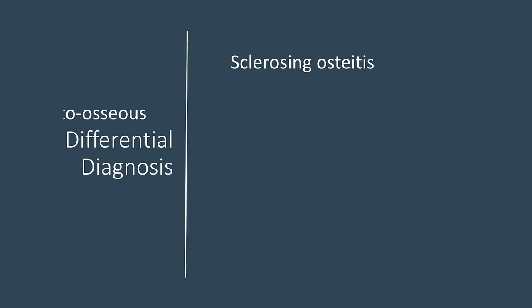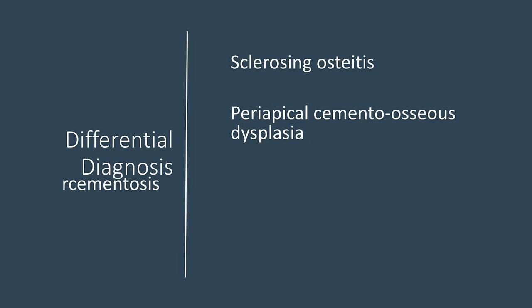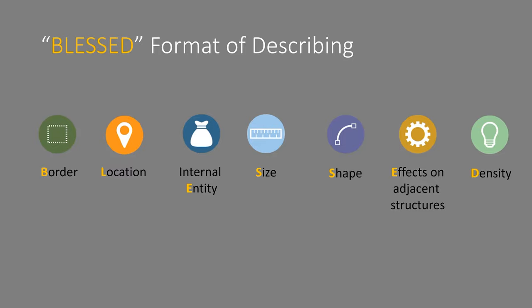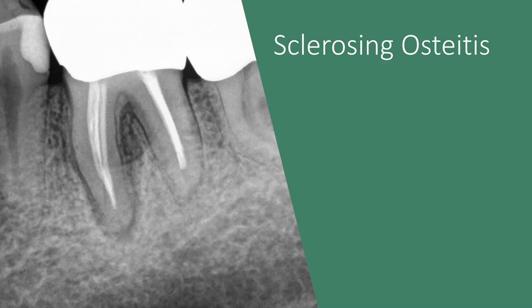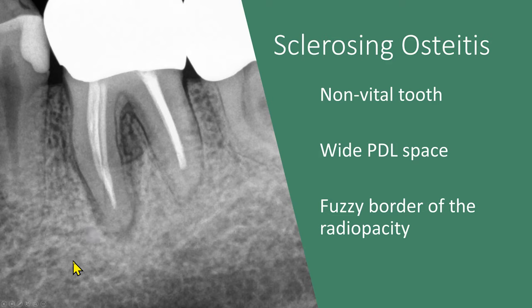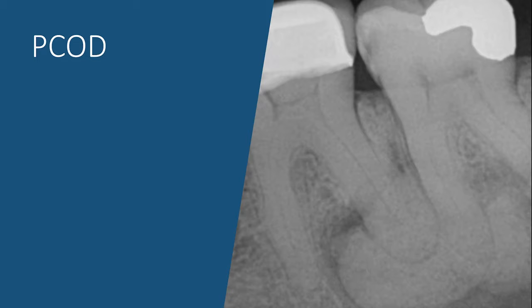The differential diagnosis of a dense bone island includes several conditions. First is sclerosing osteitis, which is seen with a non-vital tooth — the periodontal space is widened and the border of the radiopacity is fuzzy. The density is mixed, with some areas of radiolucency and some of radiopacity. In a dense bone island, by contrast, the radiopacity is homogeneous or uniform.